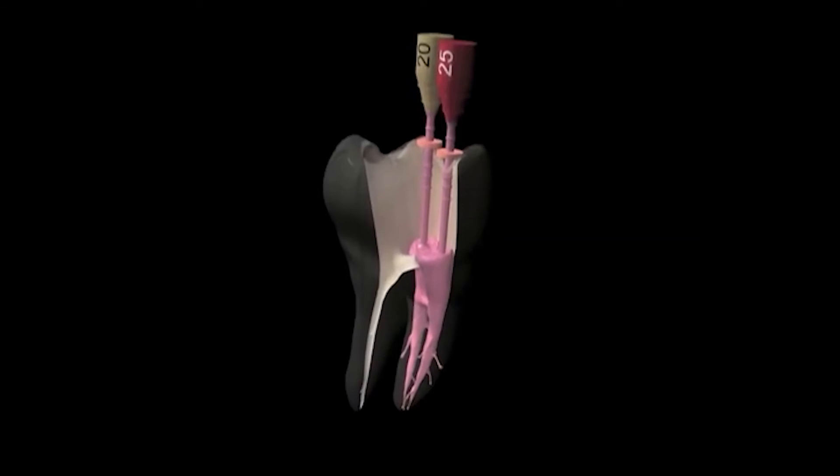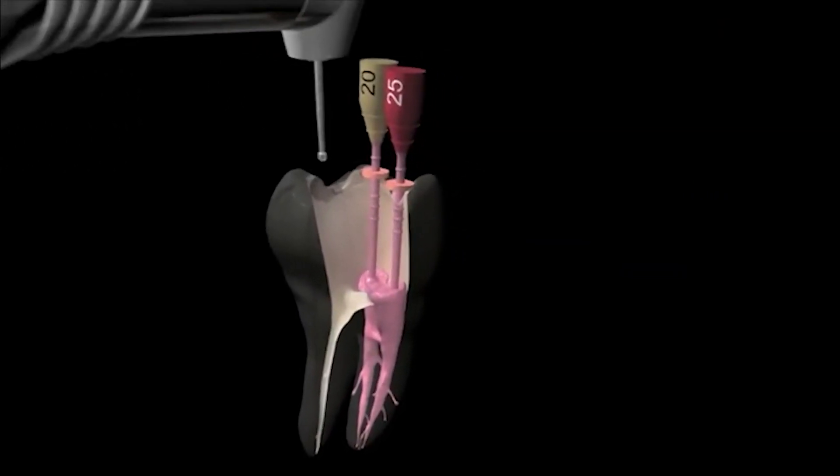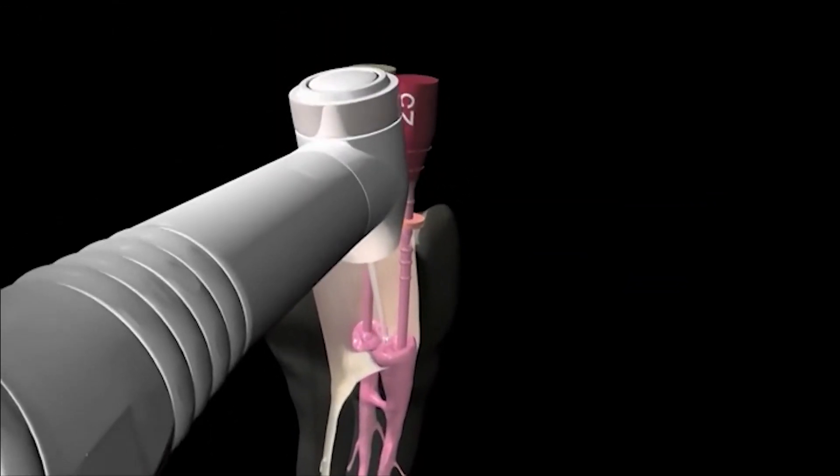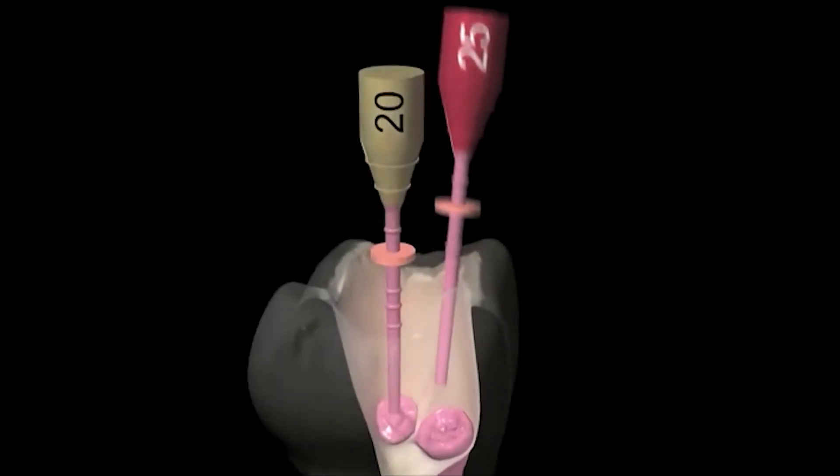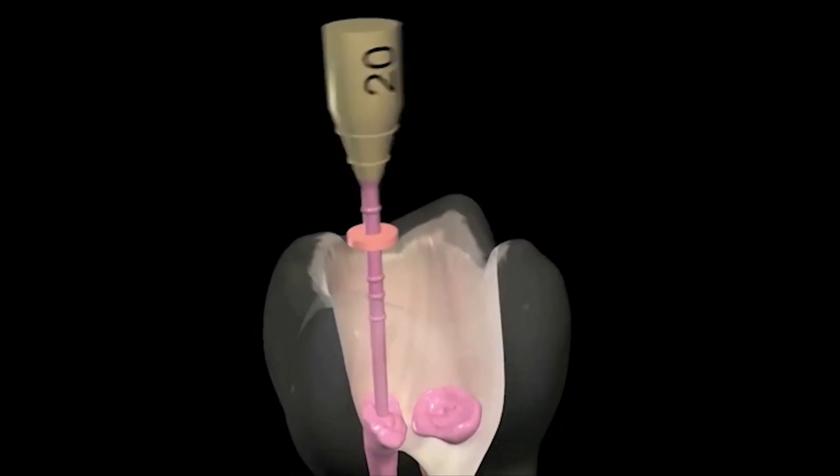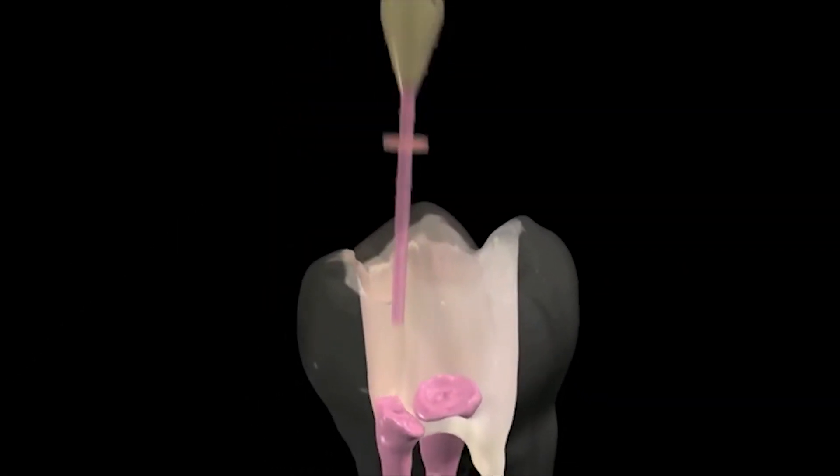When Guttapercha Core reaches its working length, use a round burr to sever the obturator at the canal orifice. You can also remove it by bending from side to side without impacting the seal.